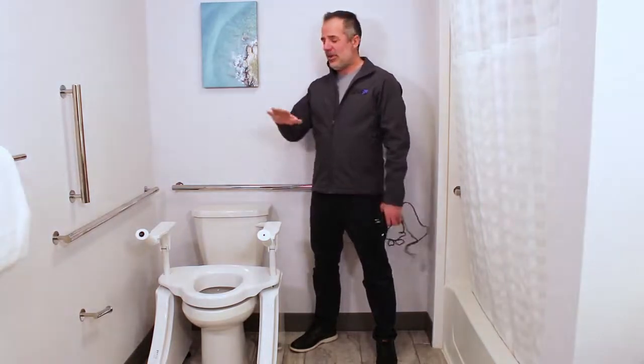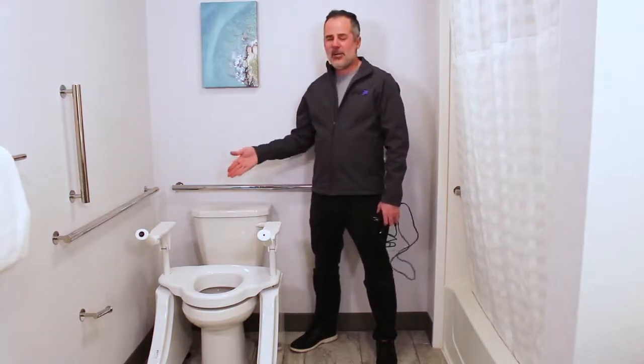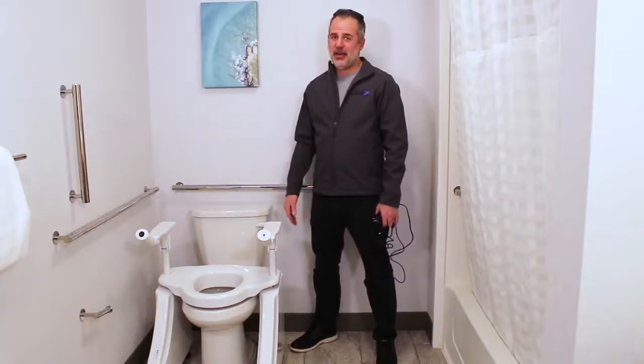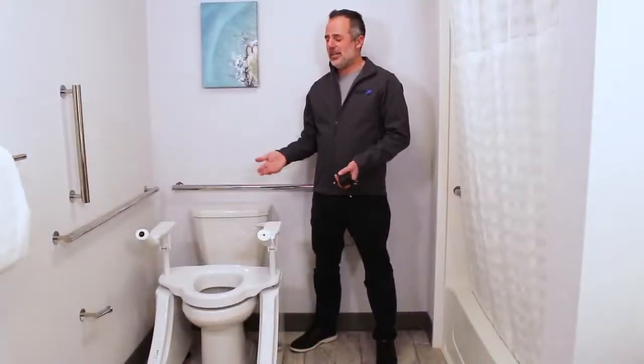One, if you don't have an outlet near your toilet — which most people don't actually — you can get 150 to 200 lifts per charge on the rechargeable battery. There's an indicator on the front of the lift that will tell you when it needs to be recharged, and when that happens it's very easy to take the battery out and recharge it.